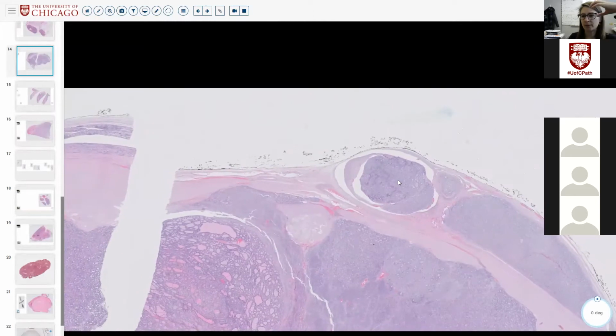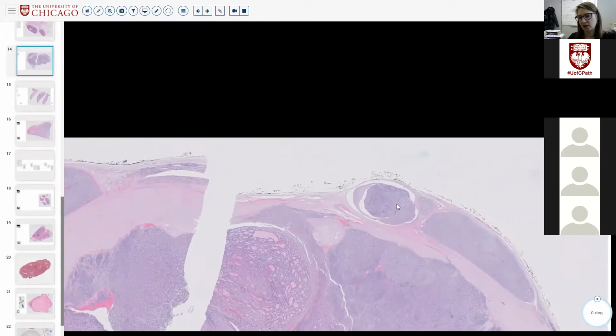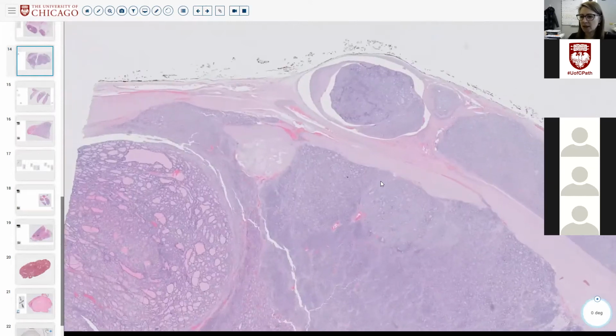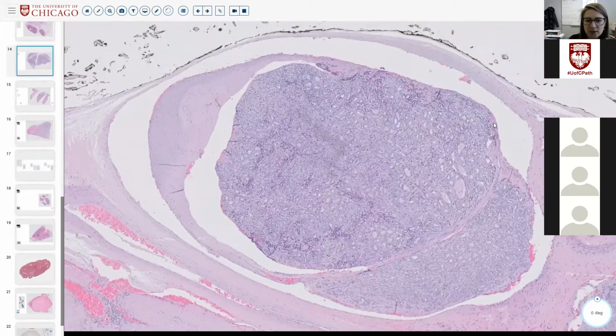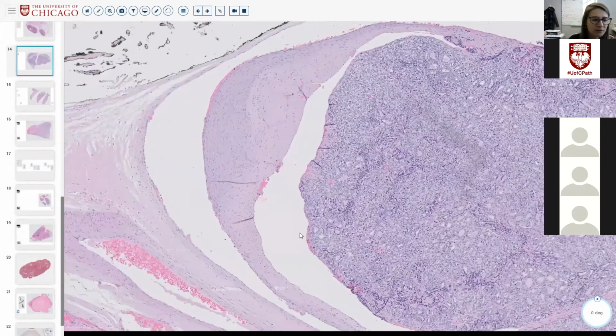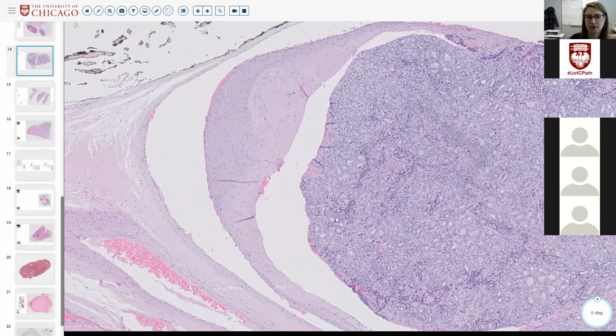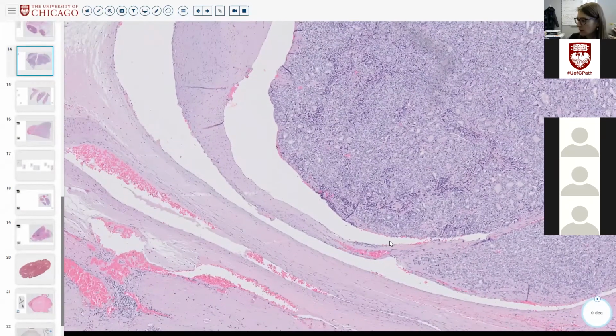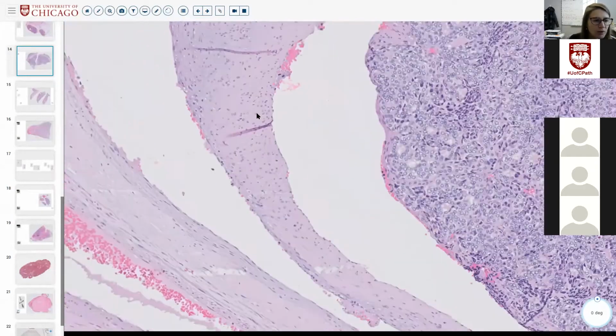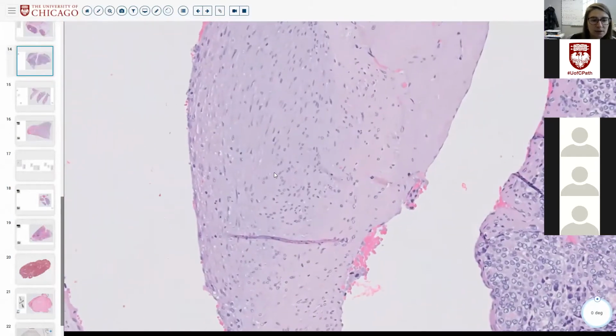You can see there's a plug, right? There's a plug that's outside of the tumor nodule. So always go check out those plugs, whether they're foci of capsular invasion and they're sitting on the opposite side of the capsule, or whether they're truly in a vessel. And so you can see here that in order to define angioinvasion, right, vascular invasion, not lymphatic invasion. Lymphatics are tiny, small, little vessels. Blood vessels are usually larger, kind of venous caliber vessels with occasionally muscular walls, as you can see here.